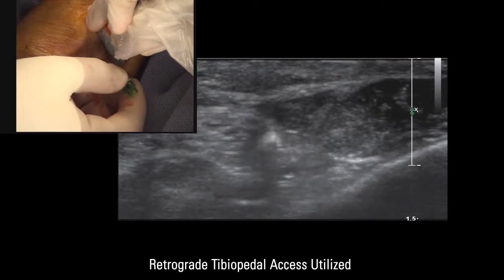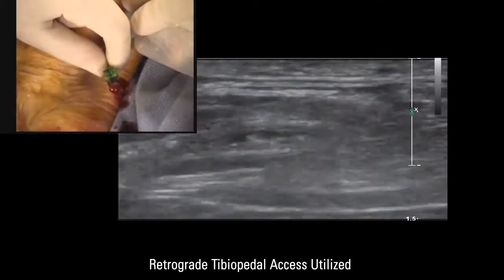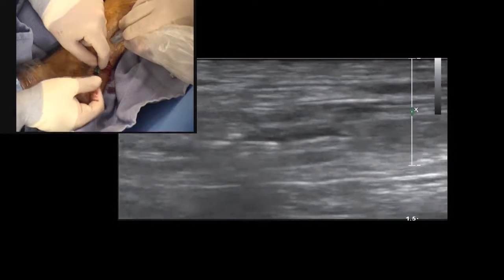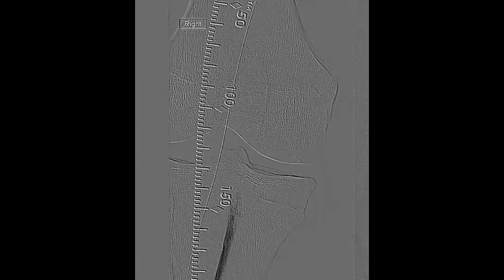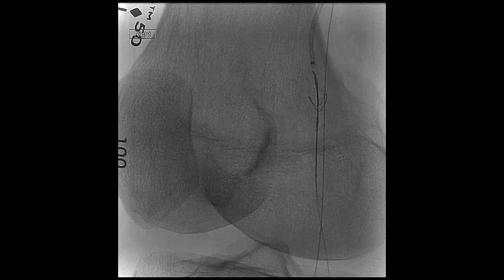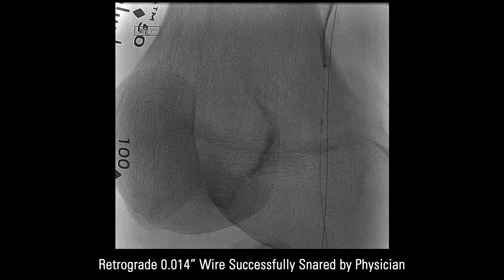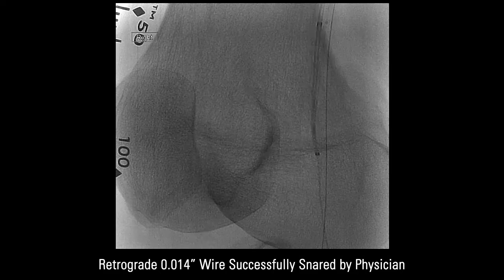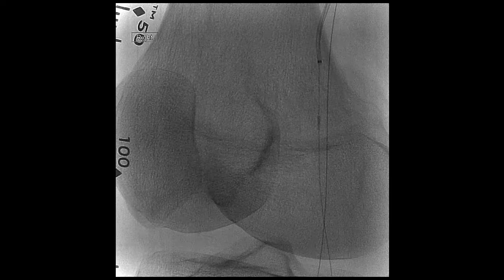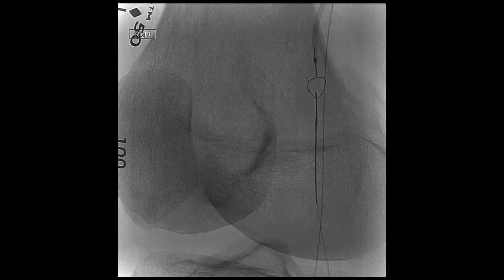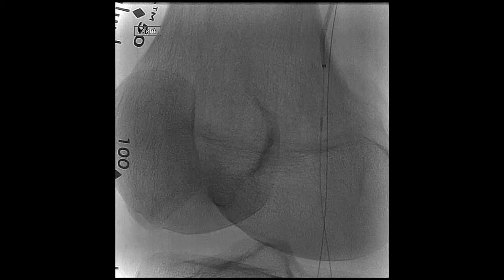The answer to this dilemma is retrograde tibiopedal access. By accessing the posterior tibial artery in a retrograde fashion, we will preserve the ostium of the posterior tibial artery without compromising the TPT trunk into the peroneal artery. After accessing the posterior tibial artery under ultrasound guidance, this is a retrograde angiogram showing a short occlusion between the TPT trunk, popliteal artery, and the posterior tibial artery. We were successful in crossing the ostium of the posterior tibial artery into the popliteal artery. We have a 2.9 French sheath inserted in the posterior tibial artery, made by Cook.